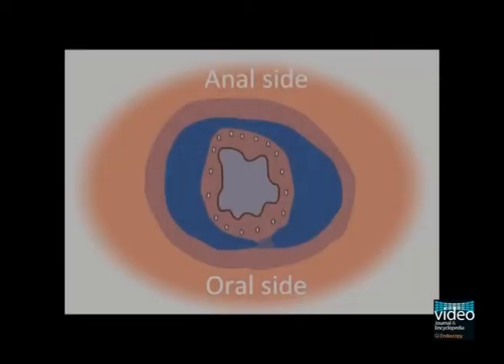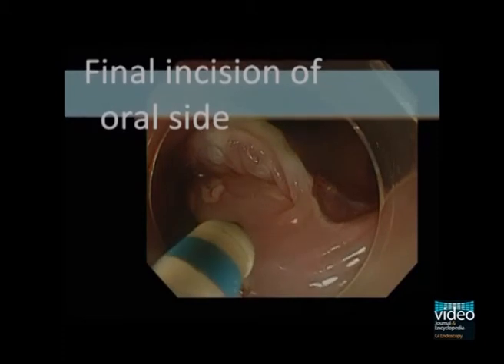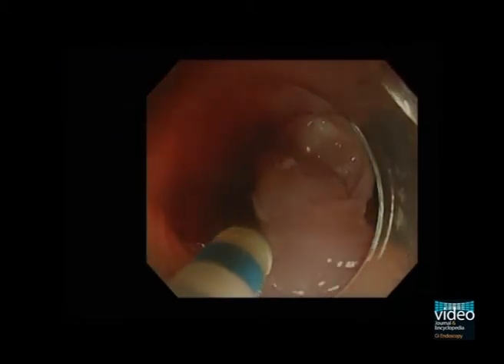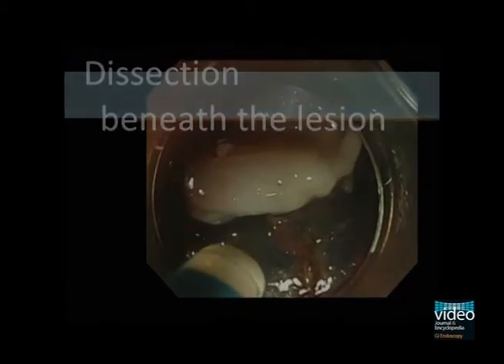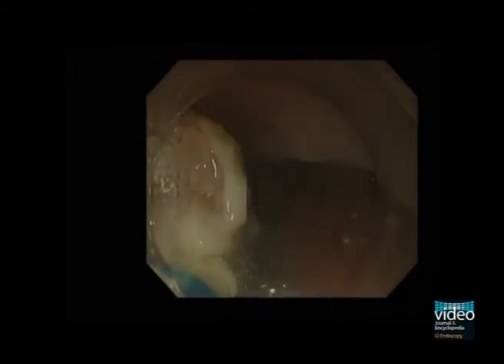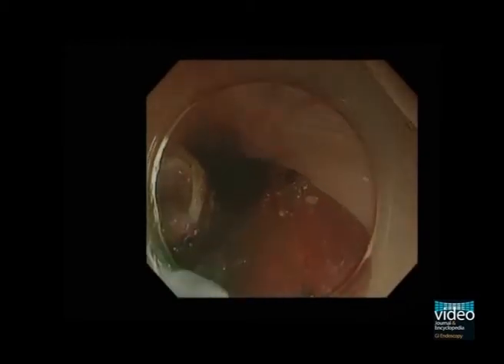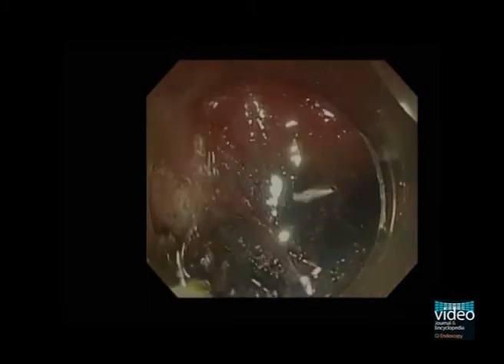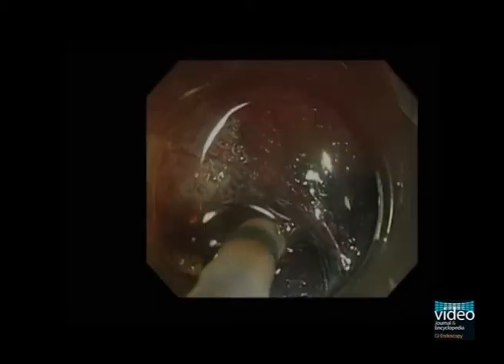Subsequently, we make the final incision at its oral mucosa to detach the flap of the lesion from oral mucosa and start dissection of submucosa beneath the lesion. After sufficient dissection of lateral sides, the submucosa beneath the lesion remains only in a narrow shape. Using transparent attachment to make countertraction, we make dissection from the edge to the other edge of the submucosa, rotating an endoscope along the lumen of the esophagus. During dissection, a small disc at the tip of the dual knife is useful to hook the edge of the submucosa.